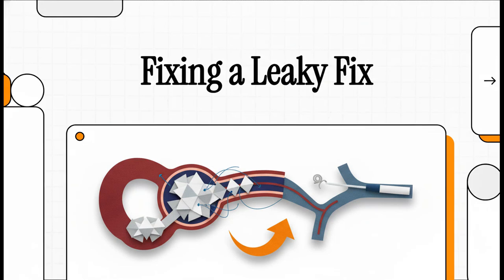Endovascular aortic aneurysm repair, or EVAR, is truly one of modern medicine's great success stories. It's a much less invasive way to fix a potentially deadly bulge in the body's main artery. But here's the question: what happens when this incredible high-tech fix starts to leak? Because for a surprising number of people, that's exactly what happens.